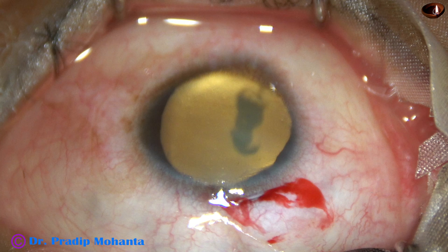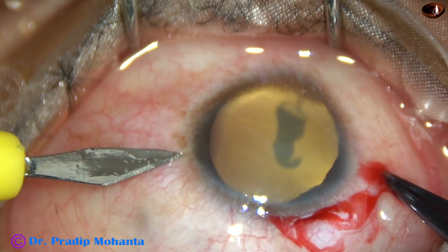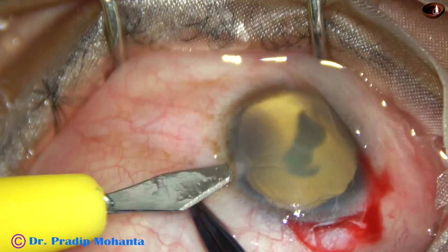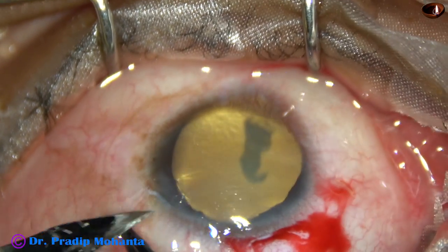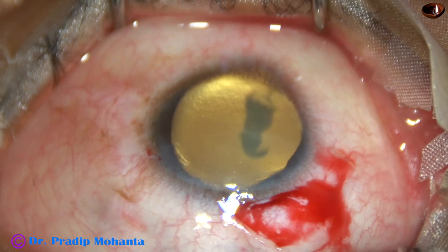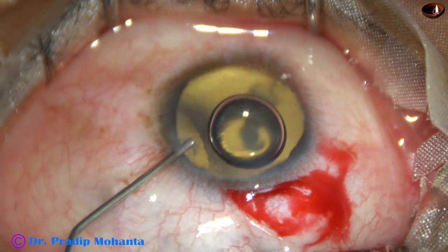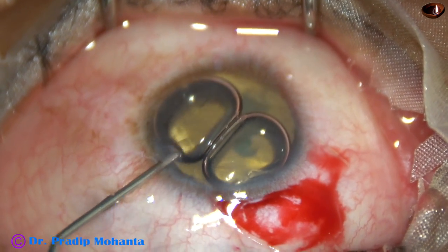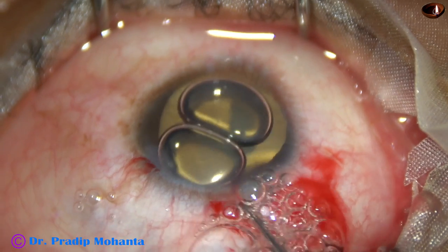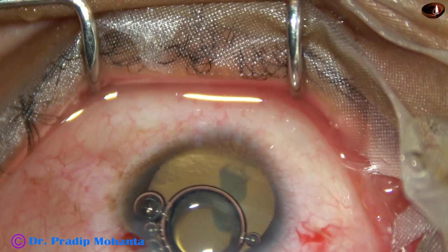I have taken up this case for surgery. I have made the main wound on the sclera at around 11 o'clock. And now this is a side port at around 2 o'clock. All the incisions are just posterior to the limbus, posterior to the corneoscleral junction. The pupil has dilated very well. But if I inject an air bubble, the air bubble is coming out, indicating some upthrust likely due to low scleral rigidity.